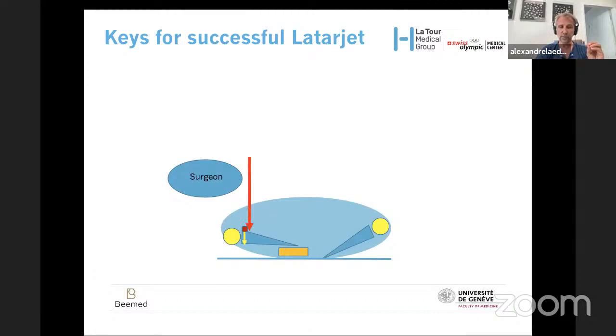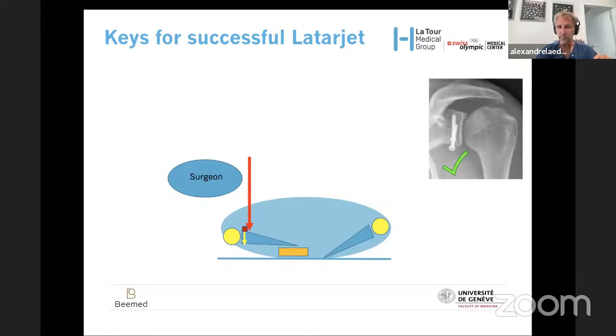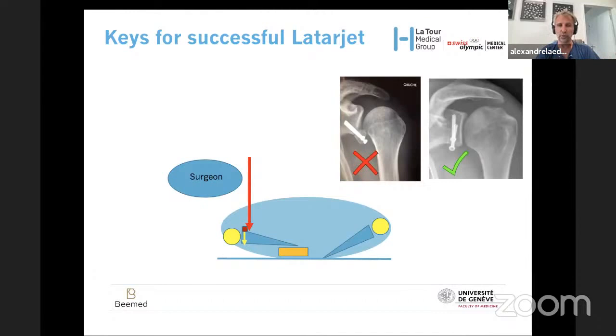Make a rather medial incision and provide some support to the medial and posterior scapula in order to have the tilt of the scapula move from 30 degrees — the resting position — to something like zero degrees. To do this, you can put a pillow between the scapula when you prepare the patient, or you can use the Tria retractor, which we'll talk about later. So this is the right way — and the red marks indicate what you should avoid. There are many tips and tricks.